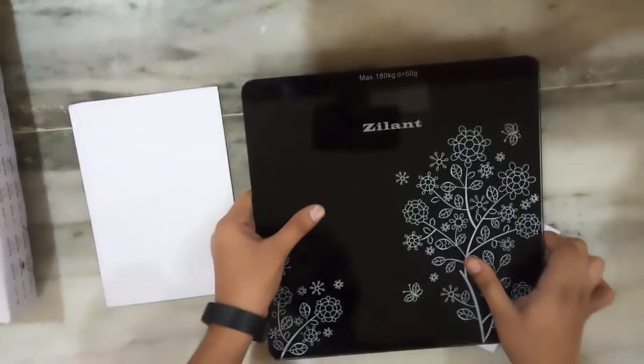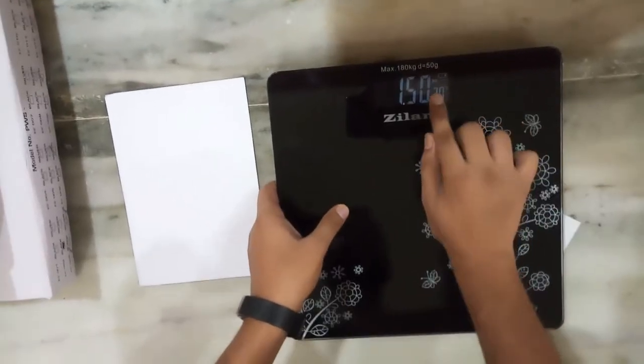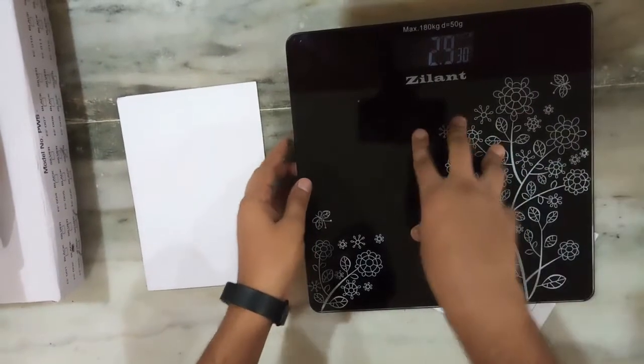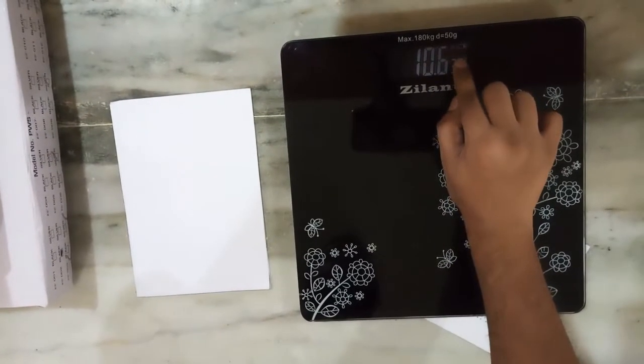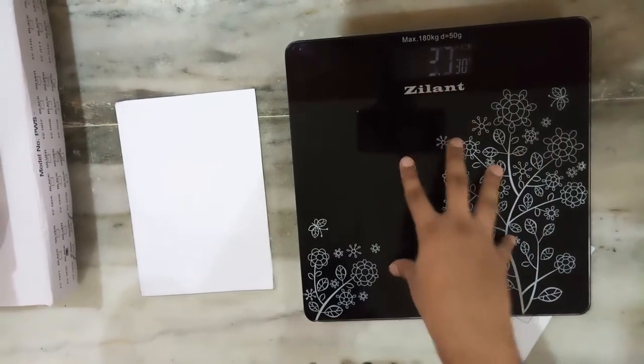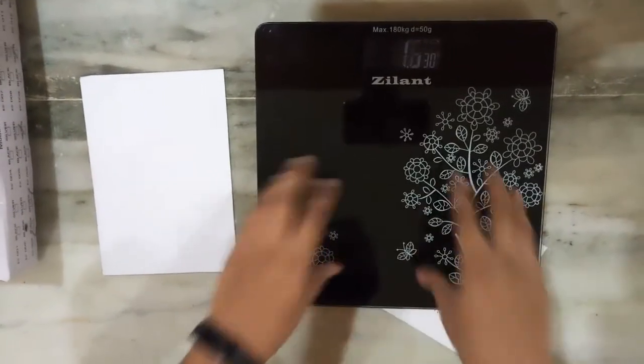Let's change the unit and see. Right now as you can see this is in kilograms. We will change it to pounds. Now the units are in pounds. Though here we can see some Chinese characters, but the measure of the weight is in pounds, so that is not a problem. We can still measure with this.